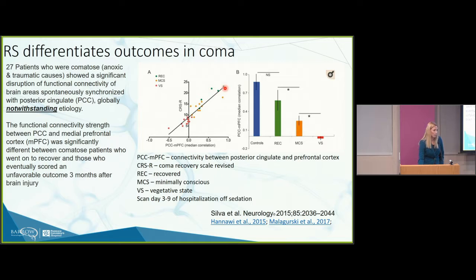And so let's go back over what the default mode network is. When we started using resting state functional MRI, we found this network that we weren't as aware of before called the default mode network. And this has turned out to be a critical network in consciousness and recovery of consciousness. It turns out that this network modulates all the other major networks of our brain. The primary location of this network is in the posterior cingulate gyrus and is present in neonates down to 28 weeks of age all the way through to the end of life. And the only situations in which the default mode network is not detected is under general anesthesia and brain death.